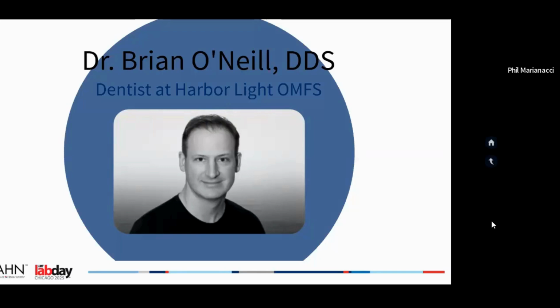And the way that this typically works, doctors are busy, and so they like to dabble in doing some of the things themselves, but a lot of times they run out of time, and it allows us to collaborate and do things together. Like I said, there's plenty to go around. And Dr. Brian O'Neill gets very busy. He does have a 3D printer, but typically he doesn't have all the time to do that. So we do sharing of either printing or planning, partial planning, of these large cases. So together.